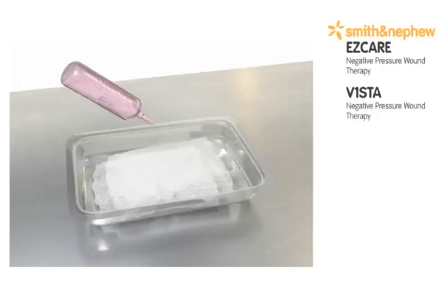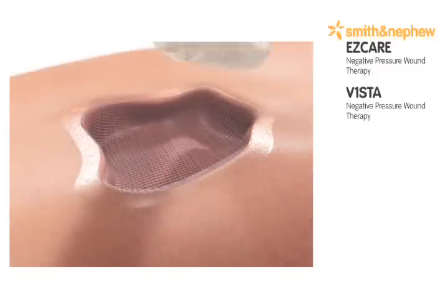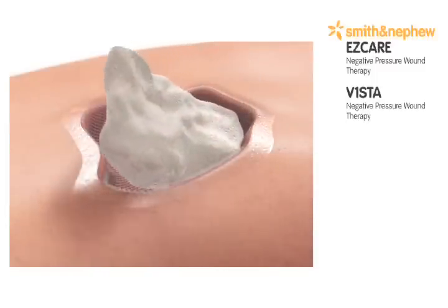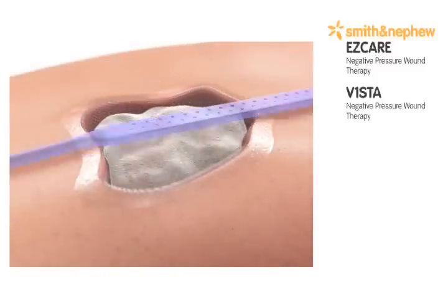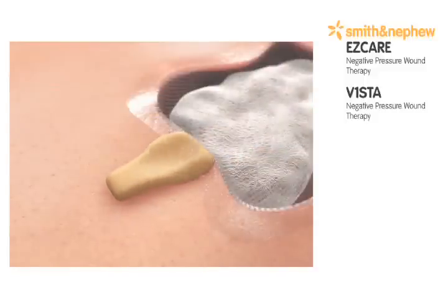Moisten antimicrobial gauze with saline and apply a layer of saline-moistened antimicrobial gauze to the wound bed. Position the drain on top of the gauze and cut the drain approximately one inch shorter than the base of the wound bed.